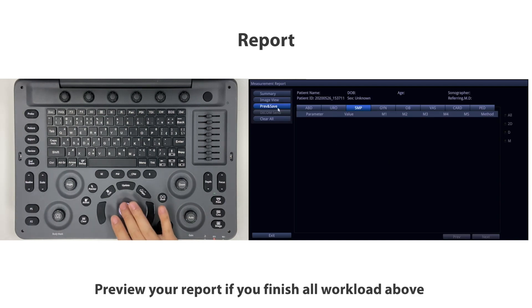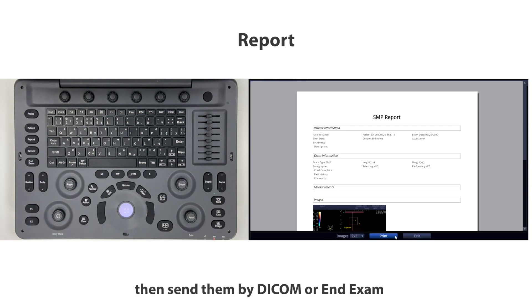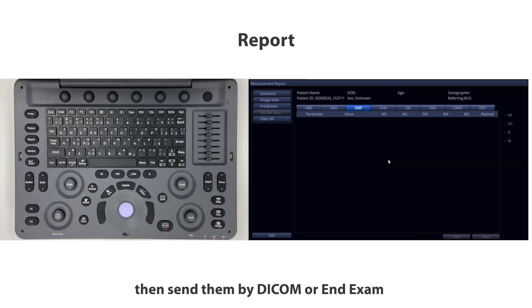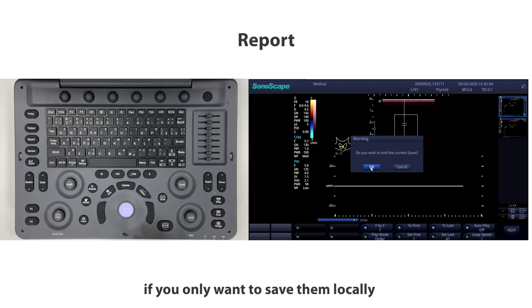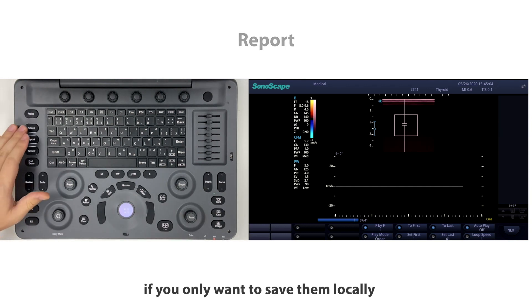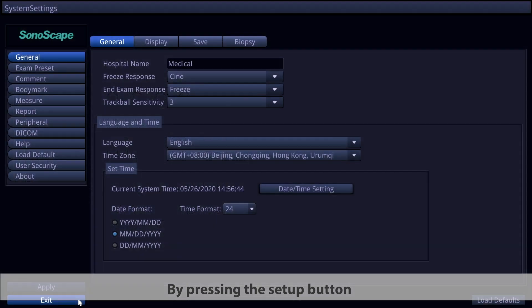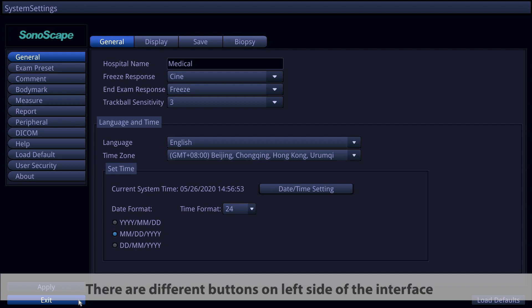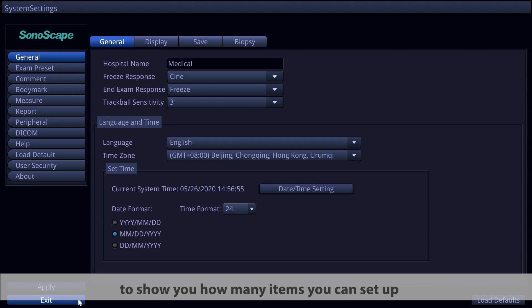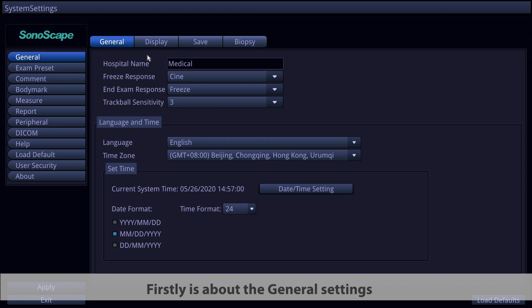Preview your report. When you finish all workload, send via DICOM or end the exam. If you only want to save locally, press the Setup button in the lower left corner of the keyboard to go into the settings interface. There are different buttons on the left side of the interface showing the items you can set up.